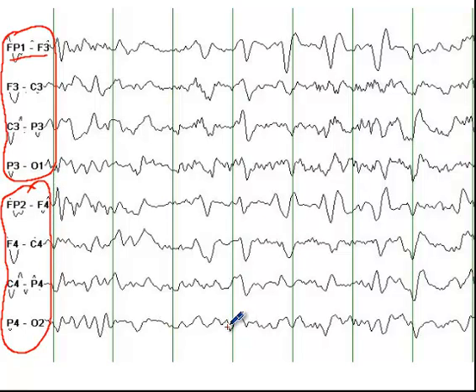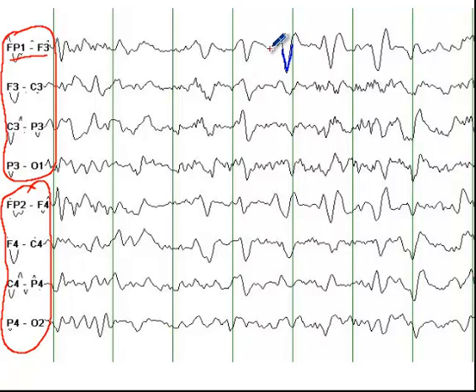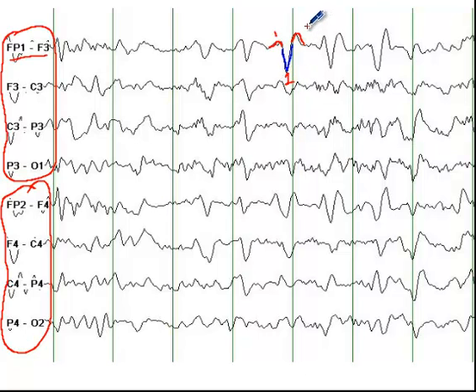So triphasic waves, as I mentioned, have a positive deflection — this is the positive deflection that we are talking about — and it is preceded and followed by two negative deflections. So this is one negative deflection here and the other negative deflection here. Altogether you have the first phase, the second phase, and the third phase. These are the triphasic waves.